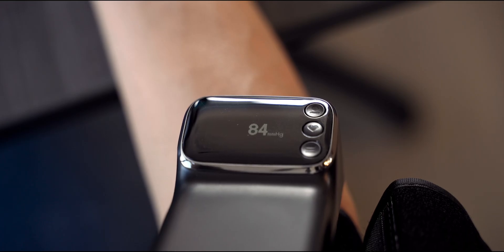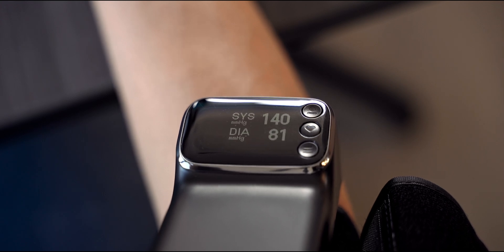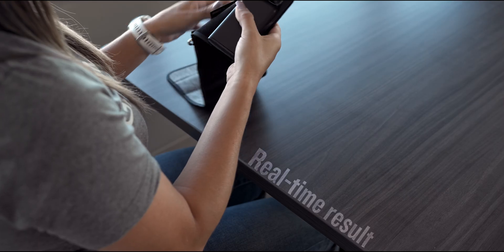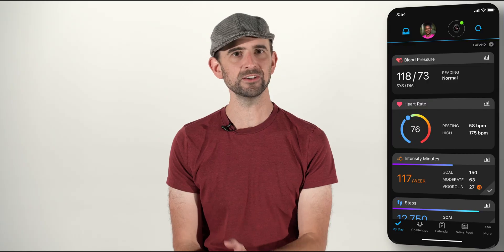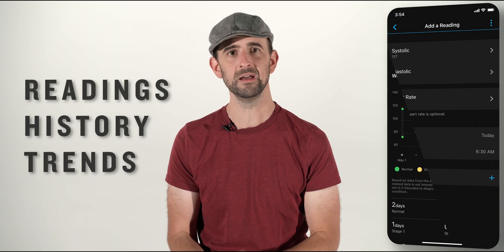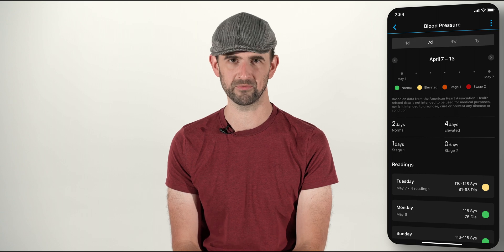Now that you've taken your measurement, what's next? The Indexed BPM Smart Blood Pressure Monitor can be used as a standalone device without the need to connect to any apps or other services, so you can view your real-time result and leave it at that. Additionally, you have the option to sync this blood pressure monitor with your Garmin Connect account where you can then view your readings, history, and trends, all directly from the Garmin Connect app on your compatible smartphone.